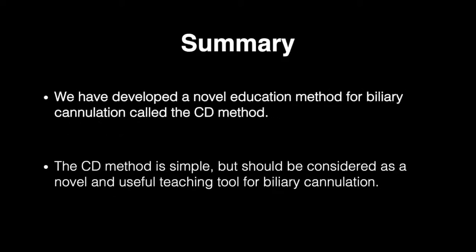However, it would be possible for trainees to understand that such papillae are difficult cases of biliary cannulation. In summary, we have developed a novel education method for biliary cannulation called the CD method. The CD method is simple but should be considered as a novel and useful teaching tool for biliary cannulation.